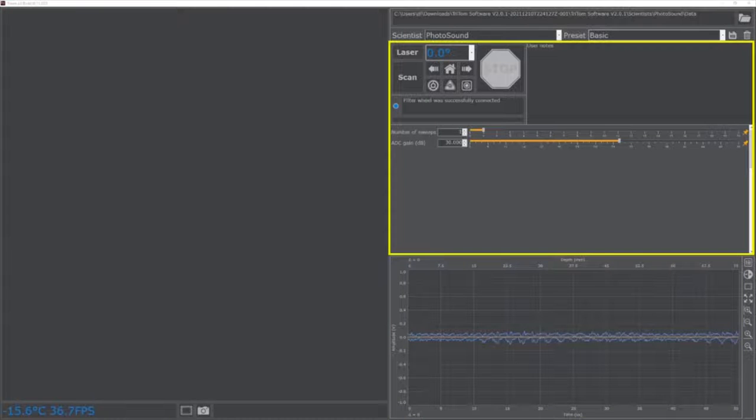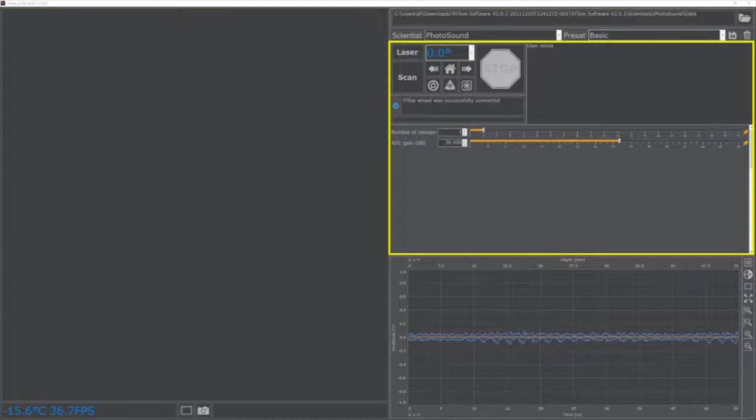Finally, the scan settings menu contains the user notes log and various settings and controls for scan acquisition. When a settings menu is selected, the active settings menu will populate with the available settings.